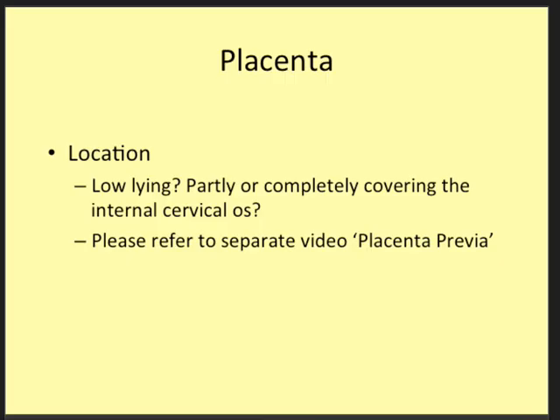The placenta. The location of the placenta. We want to find out whether the placenta is low-lying, and that means does the placenta partly or completely cover the internal os. Please refer to the separate video Placenta Previa, low-lying placenta, where this will be covered in more detail.